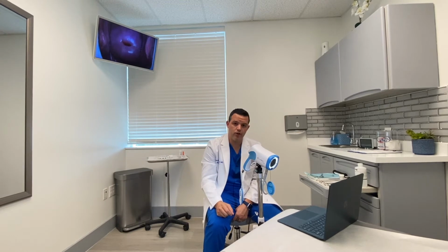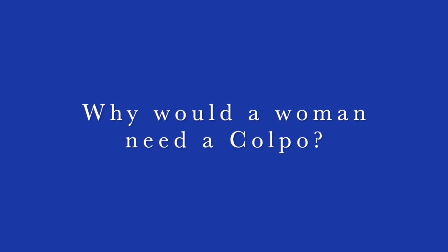If we see the abnormal cells, we would then notify you because we will have to do a biopsy. A biopsy is a little pinch of your cervix, which allows for us to get tissue, send it to the pathology to evaluate whether or not the patient has cervical cancer, or if you have dysplasia, which type you have. So women need a colposcopy because of an abnormal pap smear. Abnormal pap smears are going to be identifying abnormal cells, or sometimes they would also tell you about HPV.